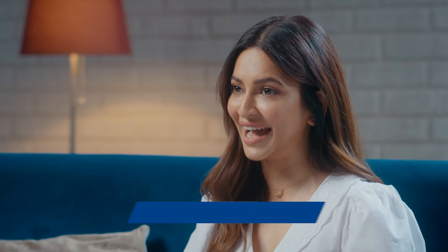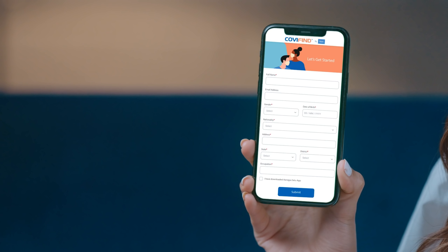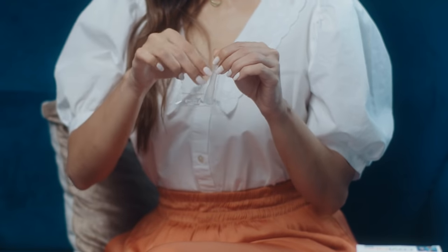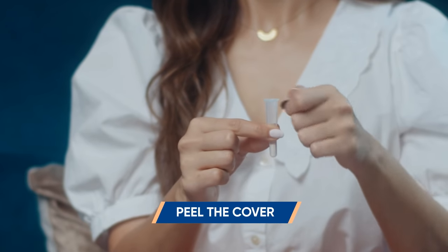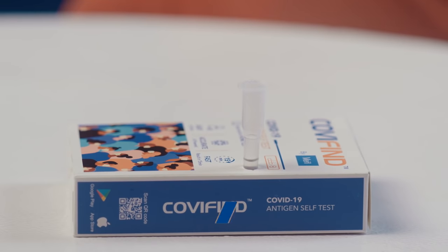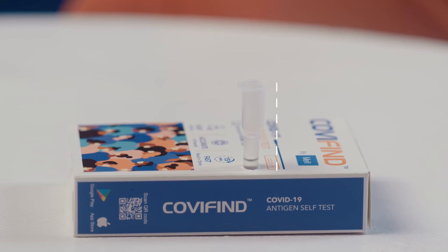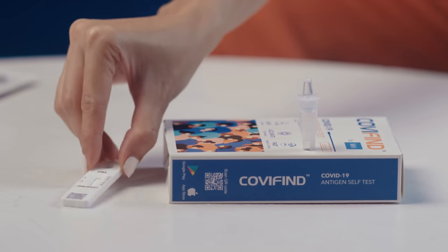Before conducting the test, don't forget to download the CoviFind app either on the Google Play Store or the App Store. Fill in all your details. Let's get started. Open the pouch and hold the tube in your hand. Peel the aluminium cover and put it on the perforated section of the box, which acts as a stand to make the process easier. Now take the test device out and keep it ready.